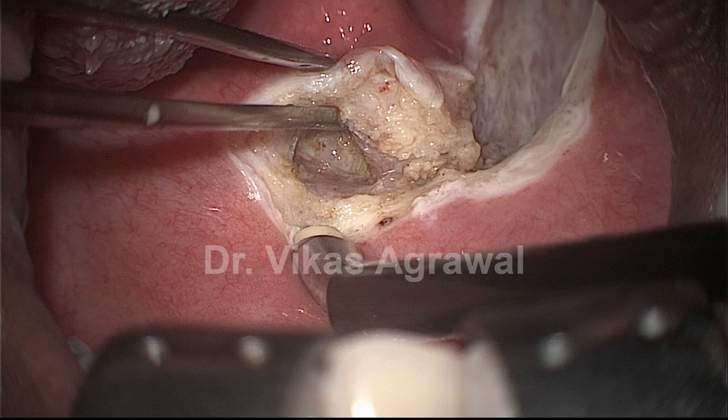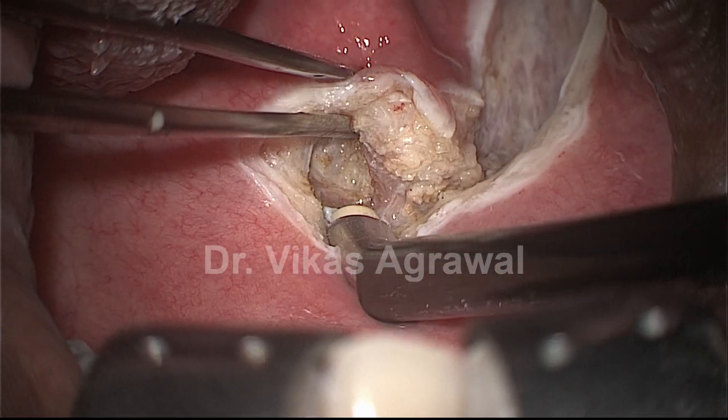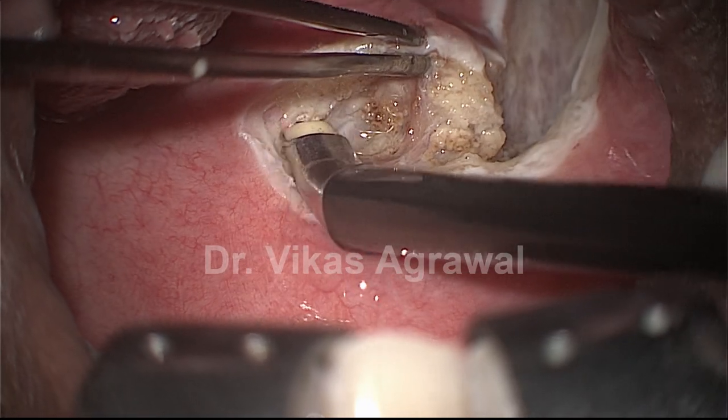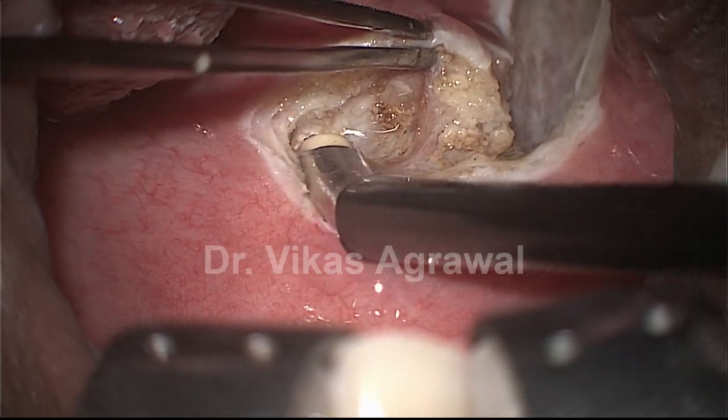Right beside the musculus uvulae this is the posterior pillar, or the palatopharyngeus. This is the horizontal muscle seen here — we are not going to get into the horizontal muscle and are only going to cut through the vertical muscle which is the musculus uvulae.